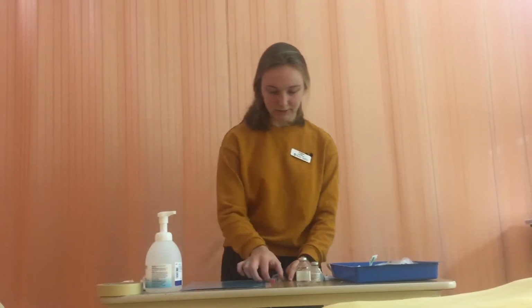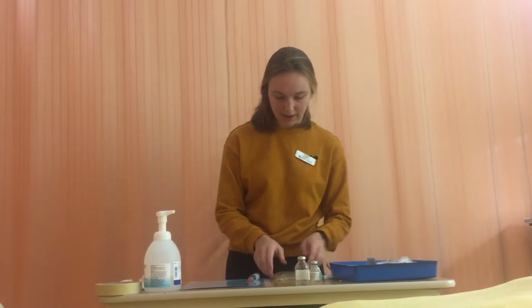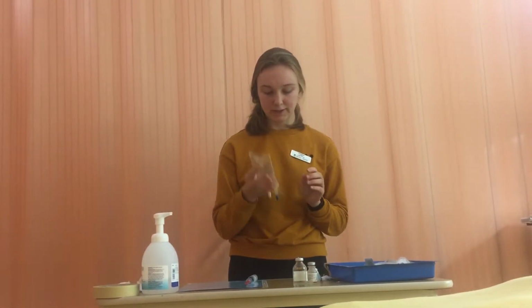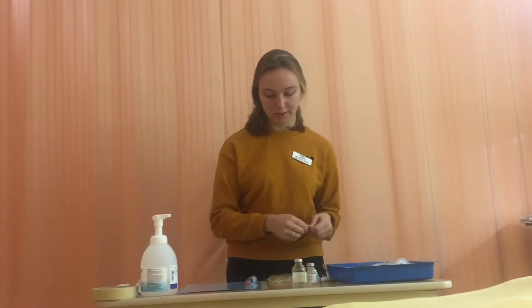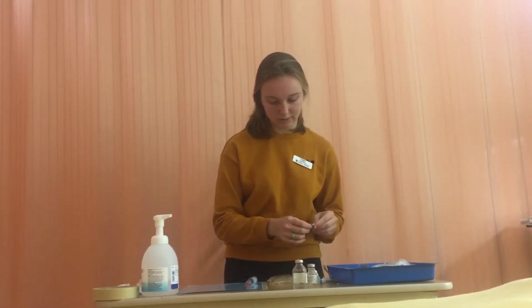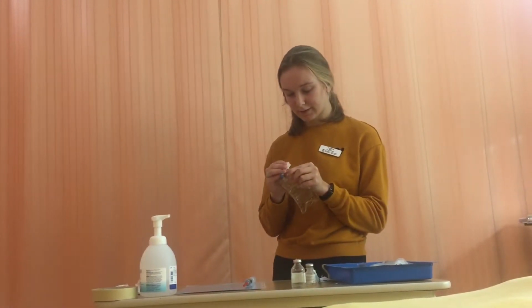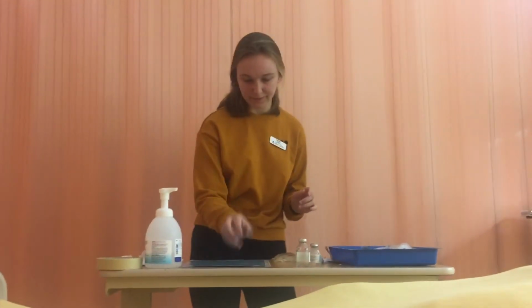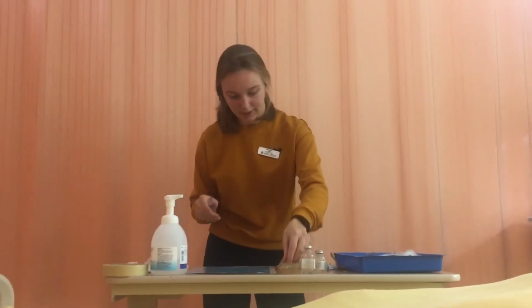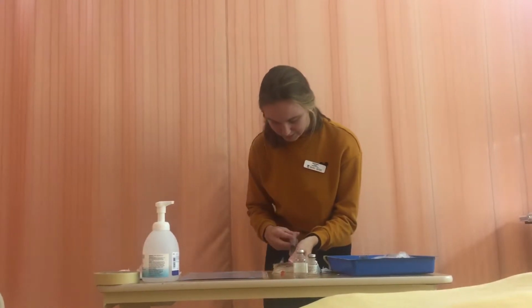So now I'm going to get my mini bag. I have my mini bag here, and it's 100 milliliters of normal saline. Like I said before, we're giving it via mini bag because she is a little bit dehydrated. So I'm just going to swab the port for 30 seconds, dry for 15, and make sure it stays sterile. And now I'm going to remove the cap and inject the medication into the mini bag.